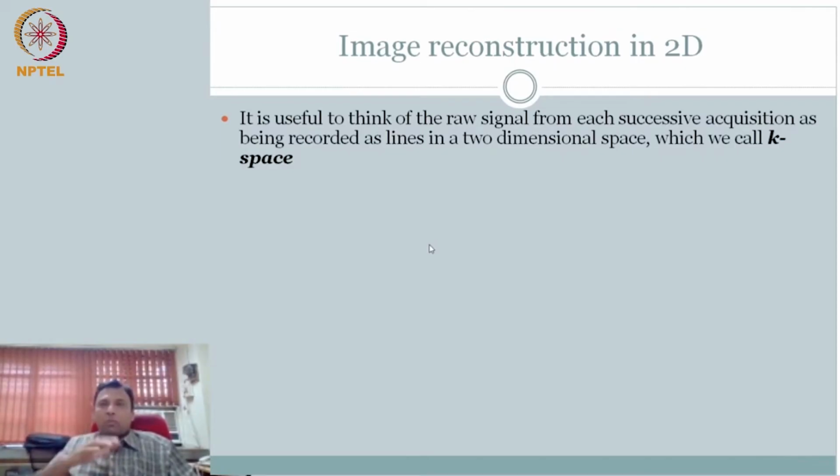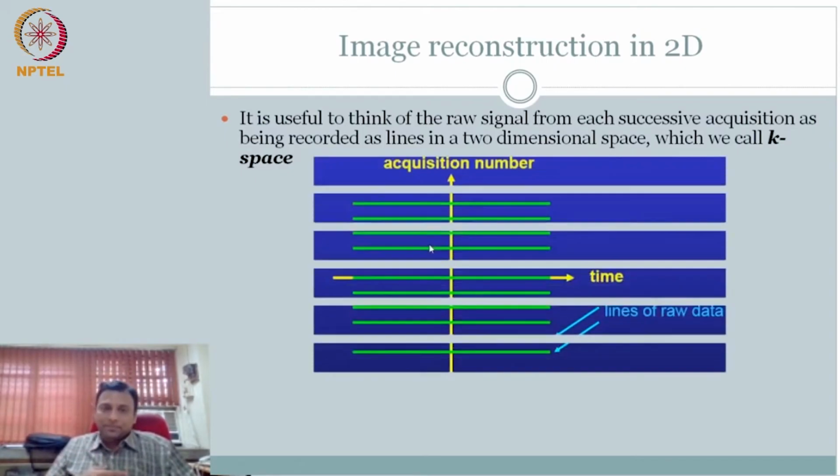So it is convenient when you talk about spatial frequencies. People talk about frequency in terms of K space. K is referring to the wave number. Okay, so that jargon is still there. But the way we have covered, your U is Kx, V is Ky. Okay, so you just have to be careful. Whatever we are covering is correct. If you are reading different literature from different backgrounds, they may call this K space. Essentially, K space is similar to what you have, just denoted as K space because of the jargon of wave number rather than the frequency.